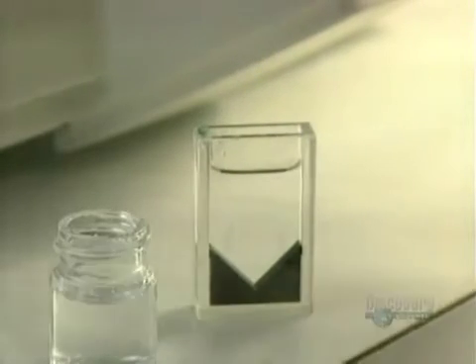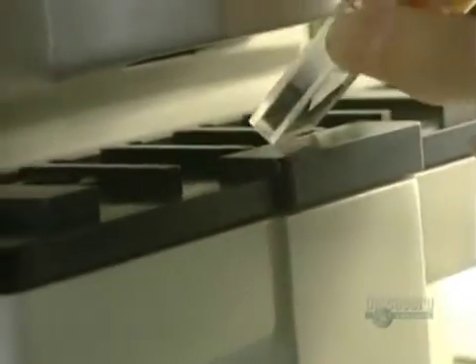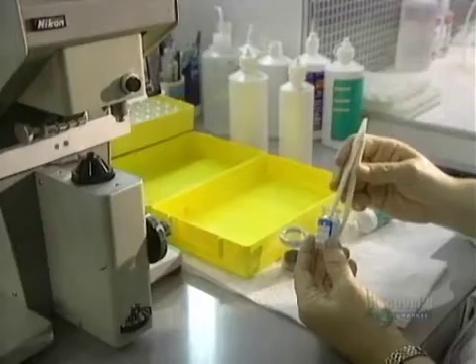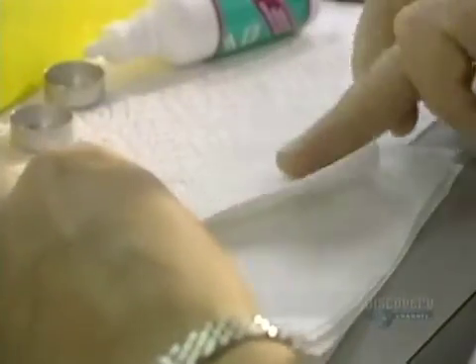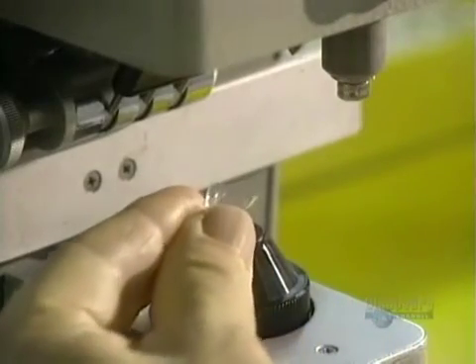This optical topographer is used to verify, through color distribution, whether the spread of optical power in the lens is precise enough to assure perfect vision. The soft, fragile lenses are always handled with the greatest of care. This unit, called a frontofocal meter, is a metering device which verifies the optical precision of the lens.